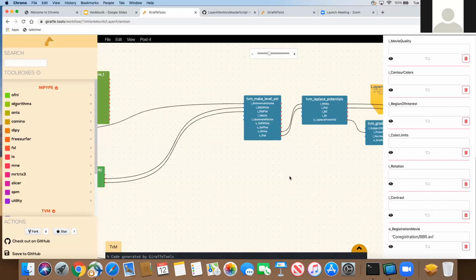So my issue is not necessarily that people can move, because if you could notice it, I would be perfectly happy to say, oh, you moved, let's go back to it again, or let's stop it halfway through. My only comment was that oftentimes with these two particular methods, I don't know until I get on my computer a day later and say, well, that's frustrating. But it kind of goes towards what you were saying. You wouldn't feel comfortable getting out of the scanning session unless you had these as reference, right?